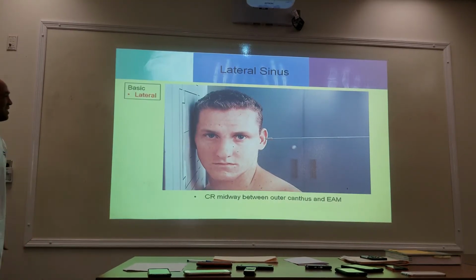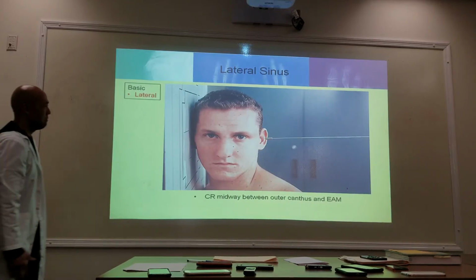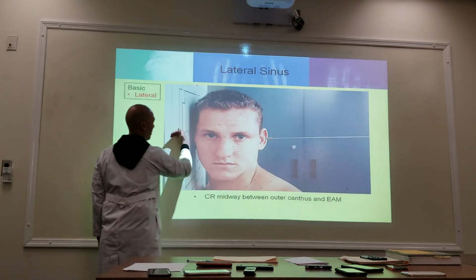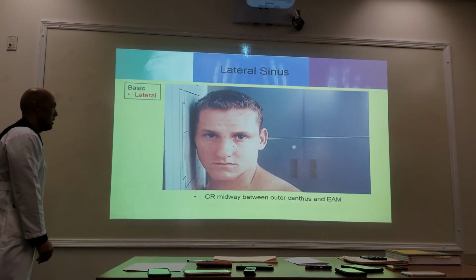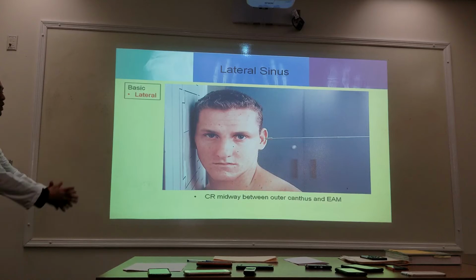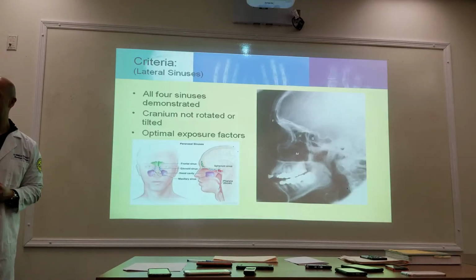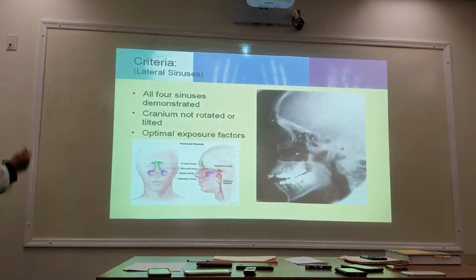All right, here's the lateral sinus. True lateral, mid-sagittal plane parallel, interpupillary perpendicular. Central ray is going to be between the outer canthus and the EAM. That was the same thing as the lateral facial bones, right? Except we're going to use a light technique, okay?